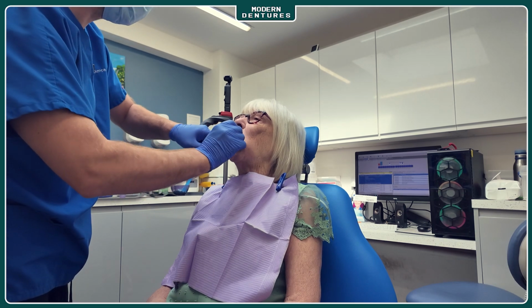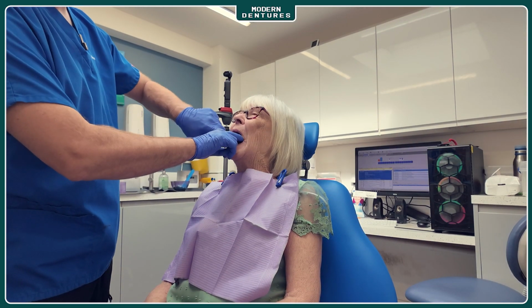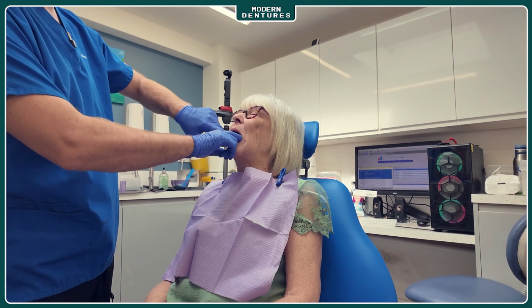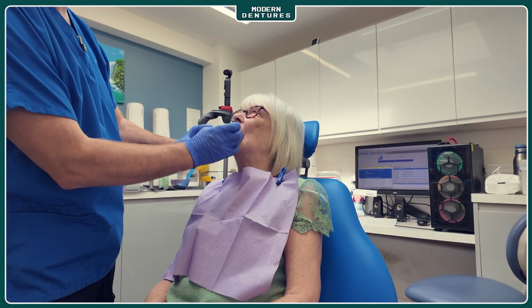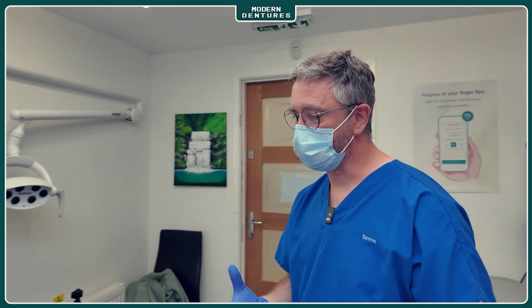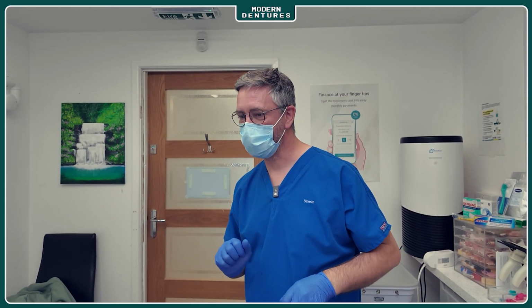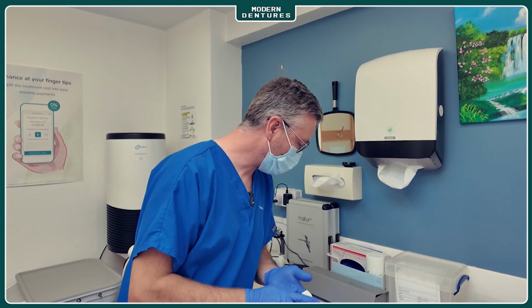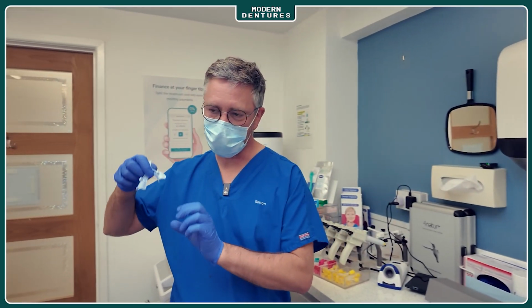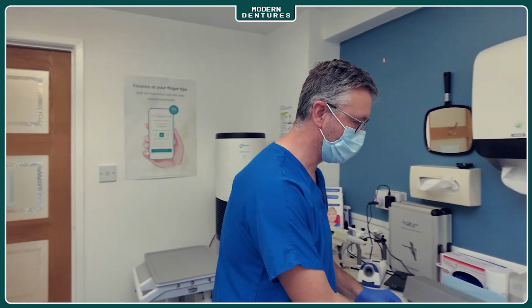Yeah, that looks good. So when I'm putting the trays in, Christine, if your mouth's open, just make sure that it's nice and relaxed there, because if you pull your lips back, it all gets tight and then it gets difficult to put it in, okay? And also, when we put the impression material in the top, if your lips are tight like that, it will push the impression material out and down the back. There's only one way for it to go, all right? And with the lower one, when we put it in, it needs to go under the tongue. So if you just poke your tongue out a little bit, that'll go in nicely.